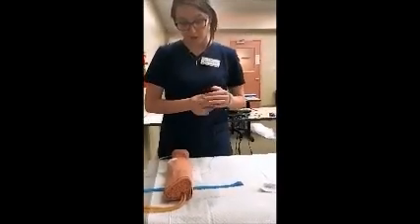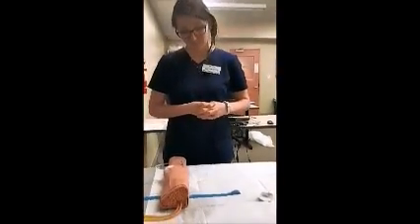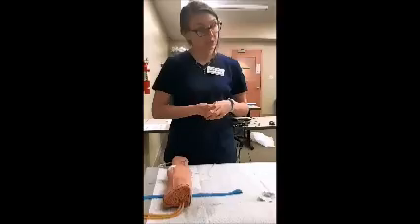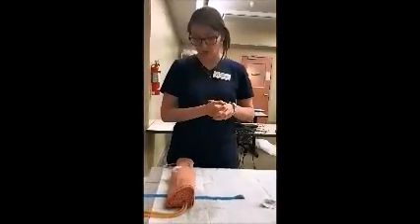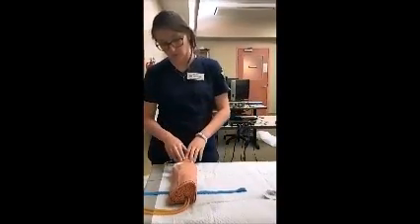All right, I know you've been here a while, and you're maybe thinking you want to take a shower soon, don't you? Yeah. Would you mind waiting on that a little bit? I'd like to keep this infusing here until it's done about 9:30 tonight. And if you're jonesing at 9:30, I'm sure we could get somebody to give you a shower. Otherwise, we could wait maybe till the morning. All right, sounds good. Because I can't have this site getting wet.